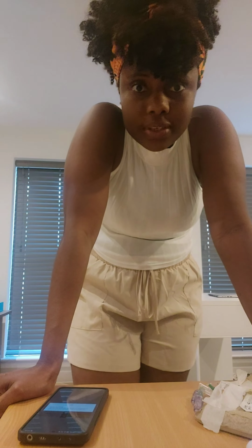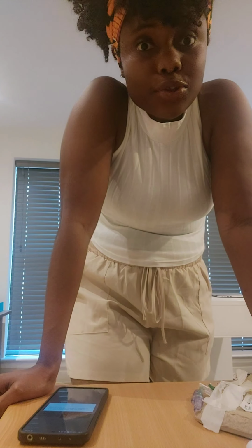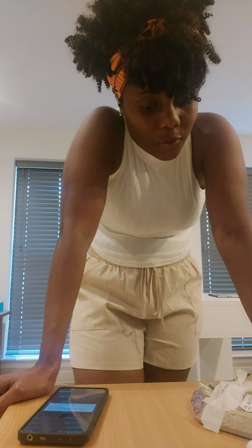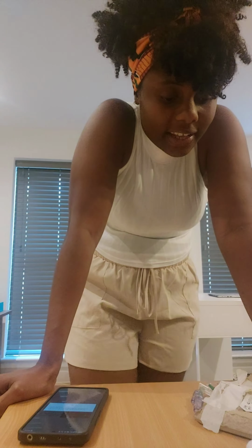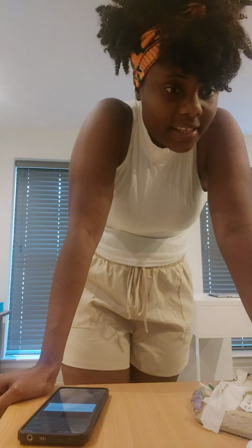And so what I'm going to do is, there's no signs of phlebitis, so I'm going to only observe the cannula. Is that okay by you? Alright, since there's no signs of infection, those signs of phlebitis, I'm going to flush the cannula to check the patency. Is that okay?